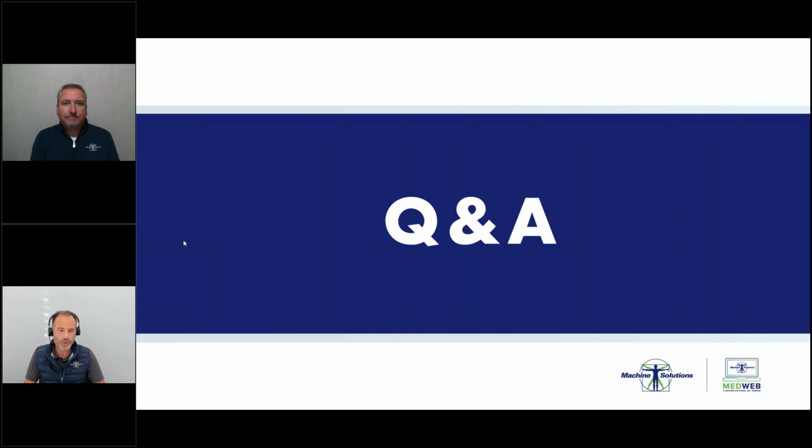Thank you so much for the question. That's not an easy one. It's a good question, but not an easy one. It's difficult to make a general statement because it's very material and product dependent. But for a PTCA or a small PTA size balloon, the following can be said as a guideline. The max balloon OD is max 5 times the tube ID.